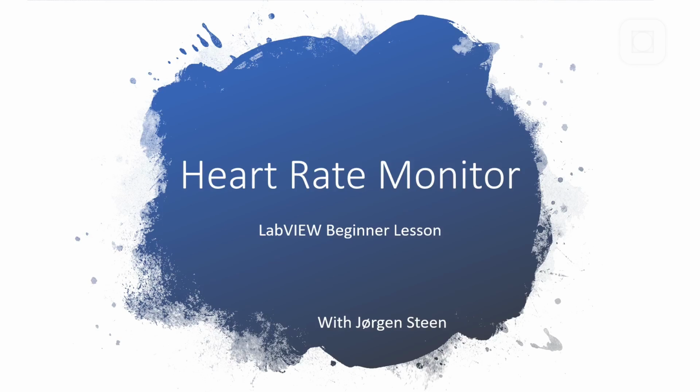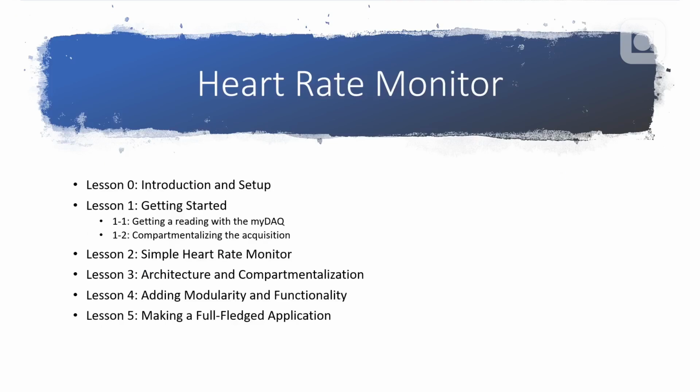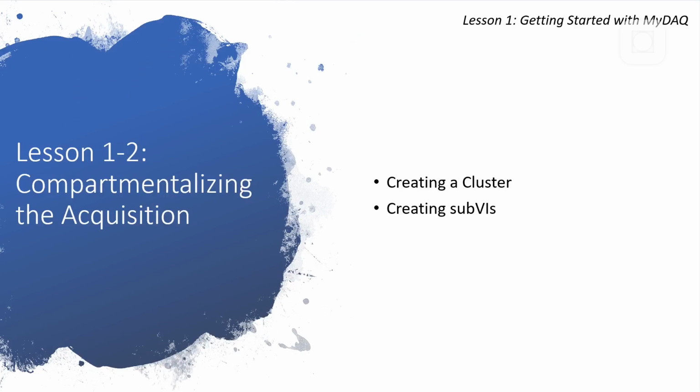This is a LabVIEW Beginner lesson where we make a heart rate monitor. This is lesson 1-2, Compartmentalizing the Acquisition. In this video, we'll be creating a cluster as a type def and exploring that. We'll be creating sub-VIs where we compartmentalize the different parts of the acquisition. We'll not be actually adding any code, any functionality, we'll just compartmentalize it.